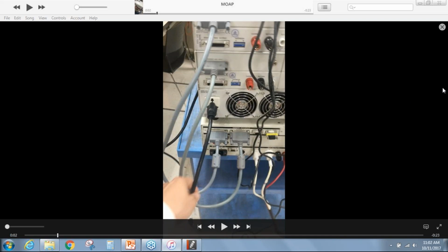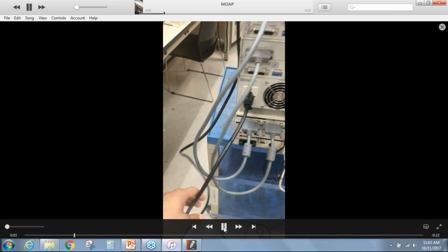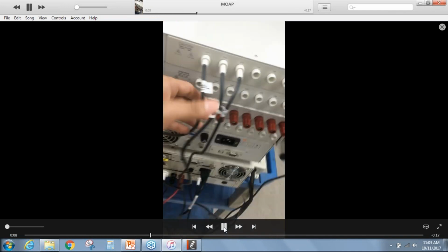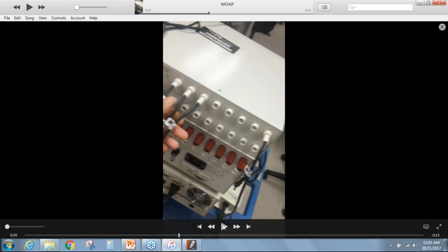So this is an output here from our isolation transformer. This is T2 coming out of this APT power source. We're going to take that and plug it in directly to one of the applied parts. Again, I have to be able to switch this, and this is where I was saying, if you don't want to be dependent on operators to make all your switching, you could have a scanning matrix where it's doing the switching for you.